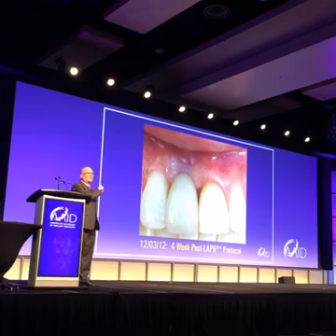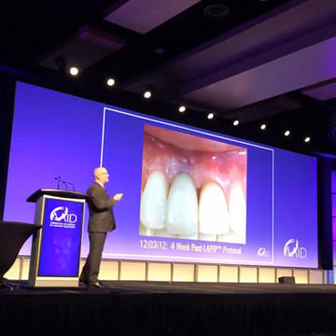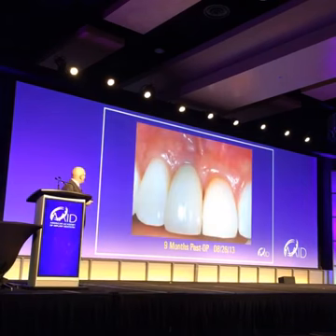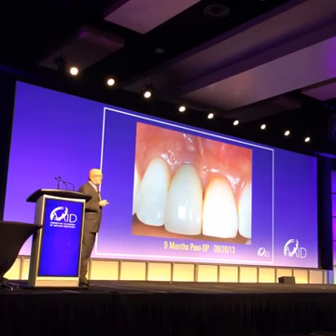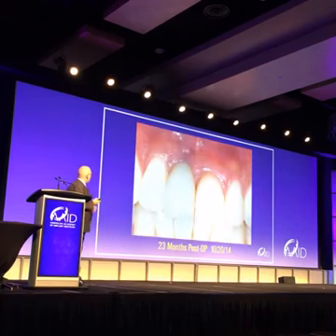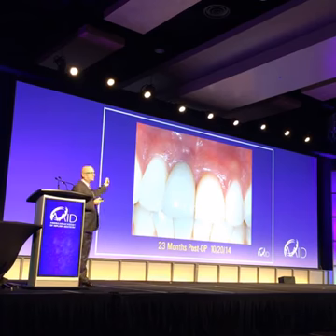Now, everyone's going to say, well, look at his papilla. He lost his papilla. Give things a chance, okay? Give gums a chance. Here it is 9 months later. The papilla's coming back, no inflammation around the implant, and look how nicely we maintain the aesthetics. 2 years later, that looks pretty good. No one would assume that he had peri-implantitis or an infection around that implant.